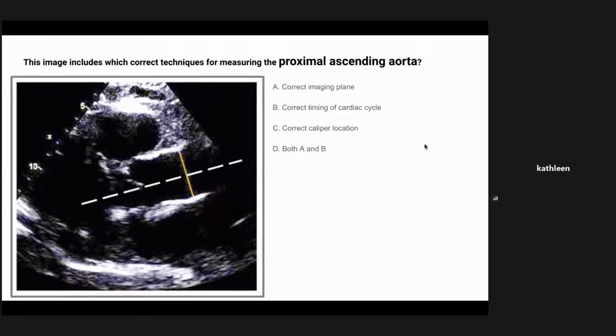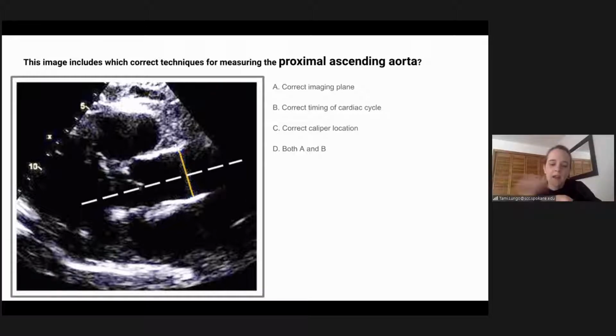Even though the correct answer is in diastole, you are saying that we should measure it when it's at its fullest, no matter where that is in the cardiac cycle? I follow that aorta clear out to the head and neck vessels, and whenever I see big parts of it, I measure them. That's just what I've always done in my practice of doing echoes. But for you guys, just do end diastole, leading edge to leading edge.